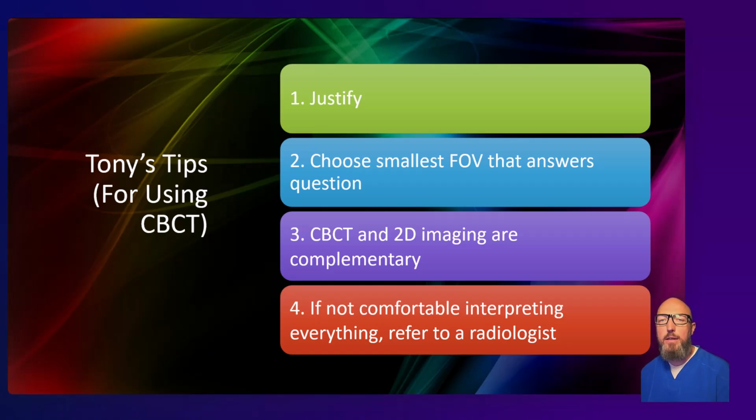They're not redundant. CBCT is not going to replace bite wing radiographs for caries detection. The metal artifact from restorations makes caries hard to see. It's also a little lower resolution. Keep using 2D radiography where it's the right tool. Specifically, I would say bite wing radiography.